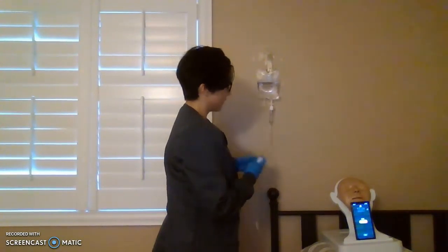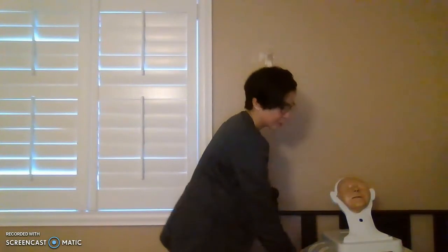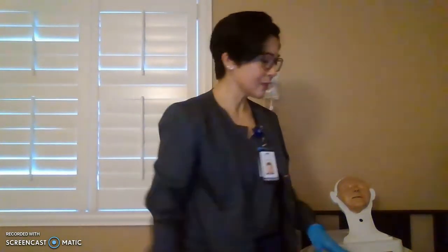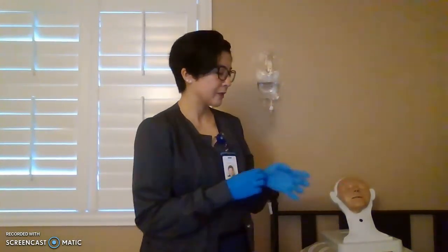Okay, so let's say that is already infusing to your patient, 38 drops per minute. So now make sure you check on your patient. There's no adverse reactions. At least stay there for 15 minutes. Document the procedure. Make sure you do good hand washing technique. Inform your patient to tell you right away if he feels any adverse reactions. So we're removing gloves, hand wash.